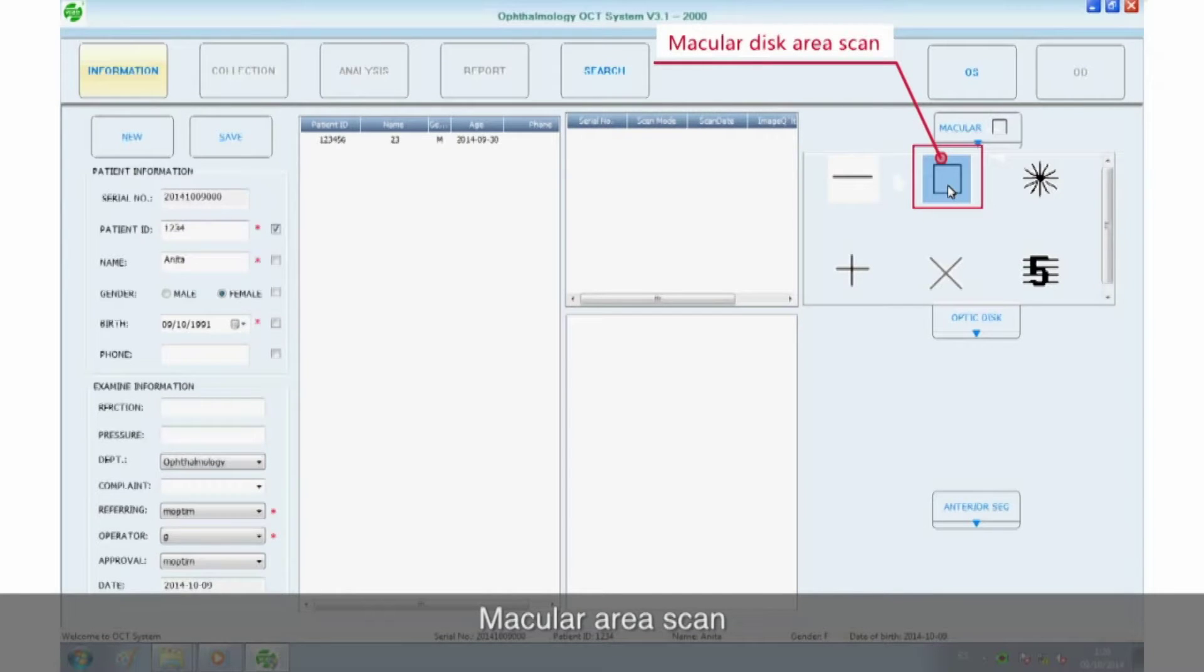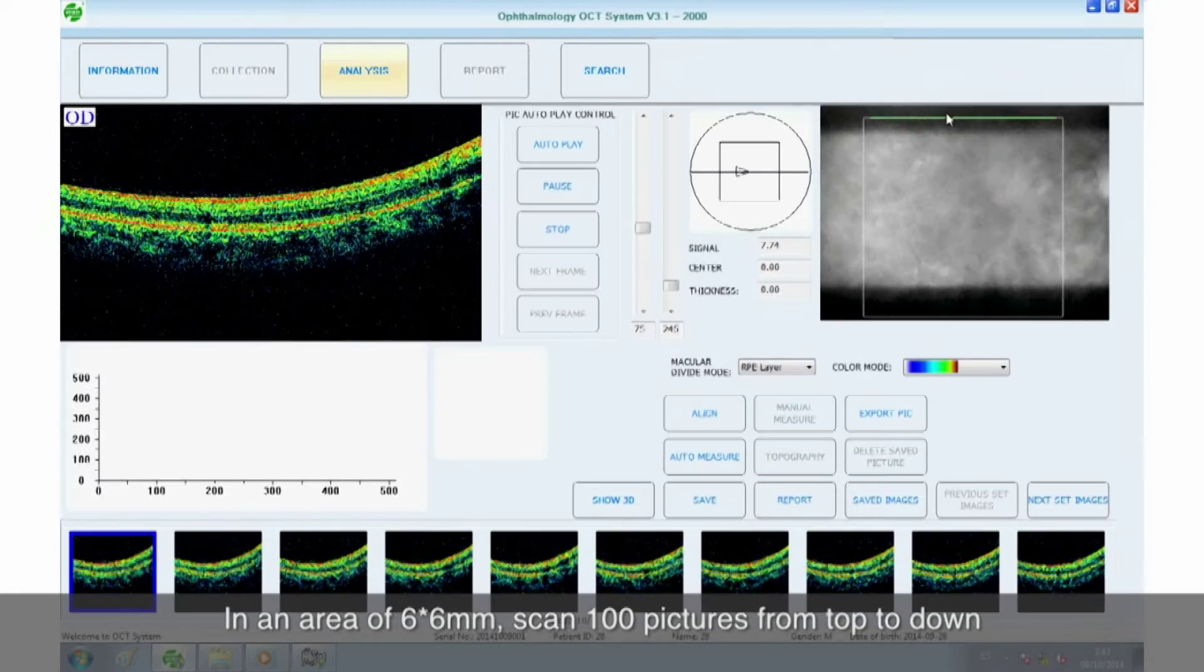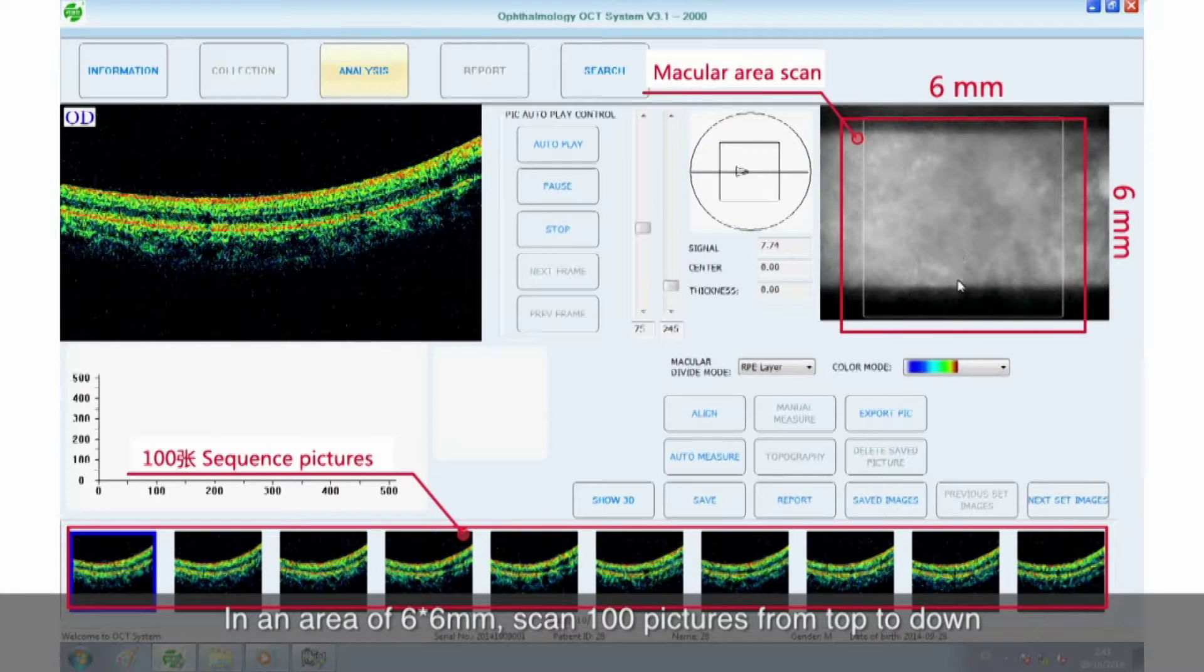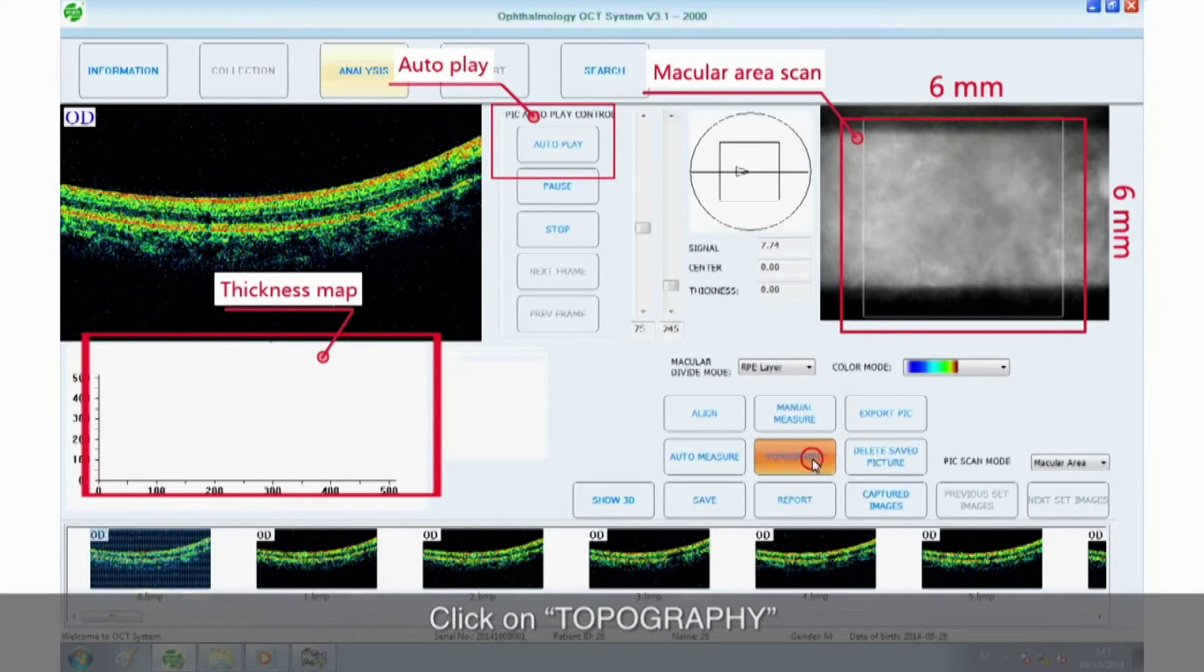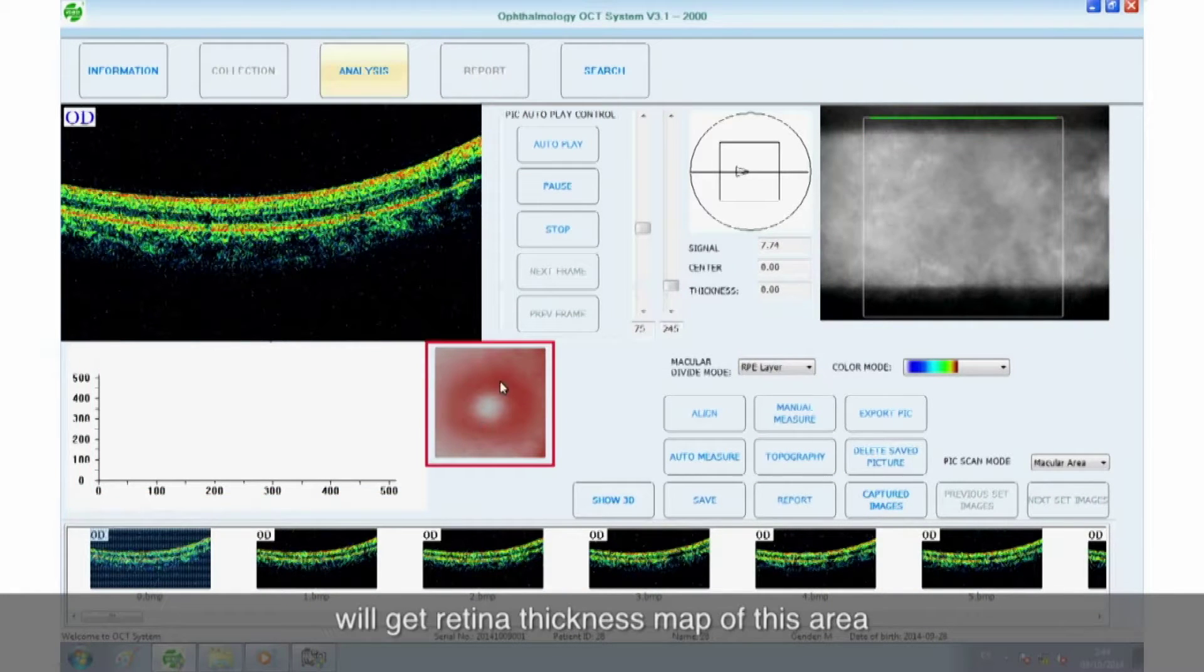Macular area scan. In an area of 6 by 6 millimeters, scan 100 pictures from top to down. Click on topography. We'll get retina thickness map of this area.